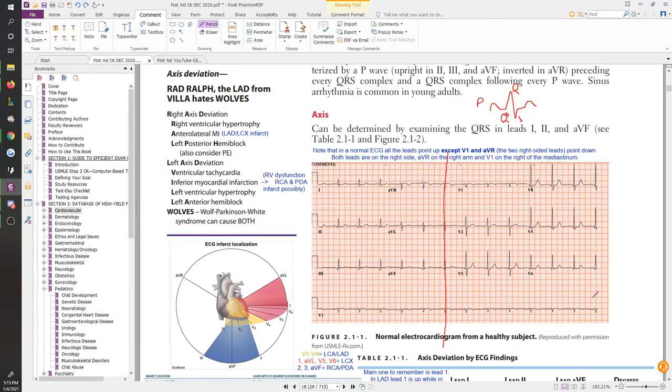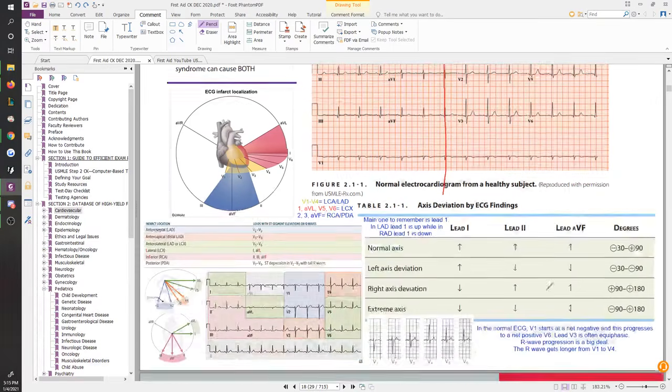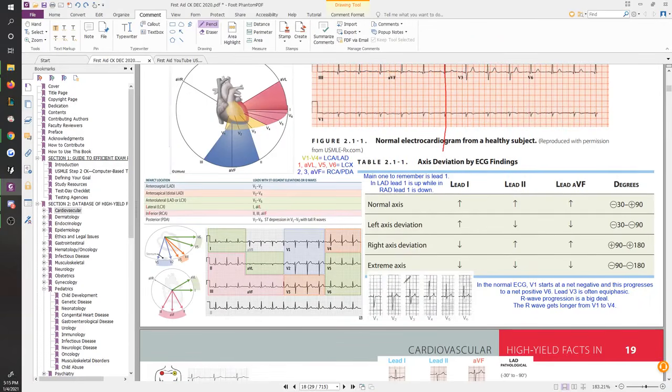So that's one thing you're going to look for. And we're going to talk about the R wave progression coming up pretty soon as well. This is another image here showing you the R wave progression, right? So you can see how in V1 it's down, and then it's slowly coming more up, right? And that's your R wave becoming taller as you go from V1 to V6 in this image down here, okay?